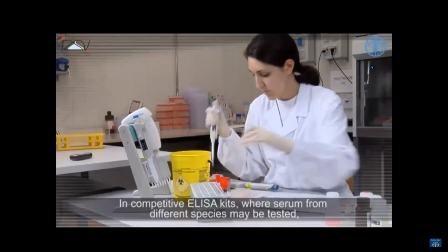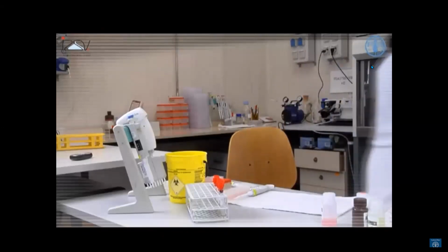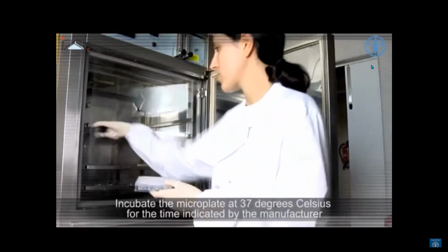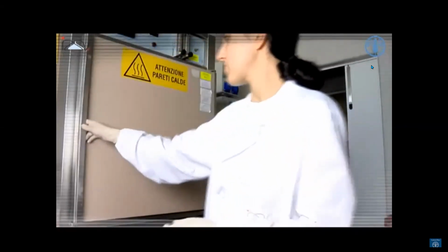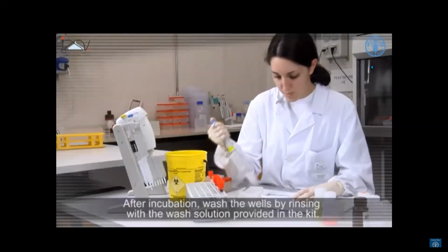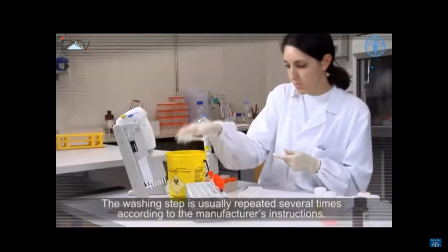In competitive ELISA kits, where serum from different species may be tested, specific dilution factors are indicated in the instructions, depending on the species under examination. Incubate the microplate at 37 degrees Celsius for the time indicated by the manufacturer to permit the development of an antigen-antibody immunocomplex. After incubation, wash the wells by rinsing with the wash solution provided in the kit. The washing step is usually repeated several times according to the manufacturer's instructions.